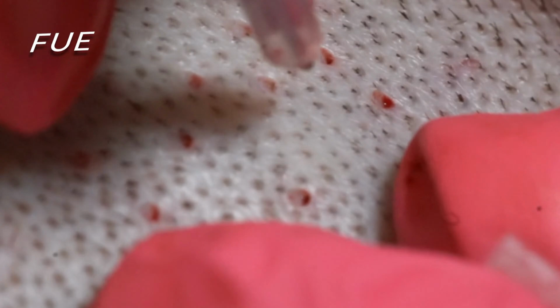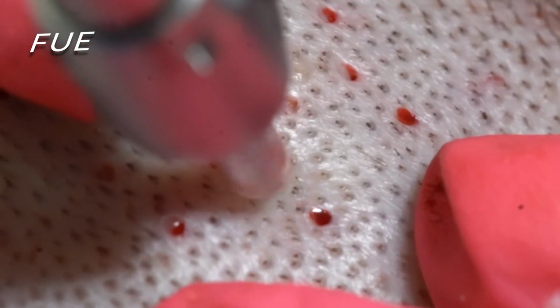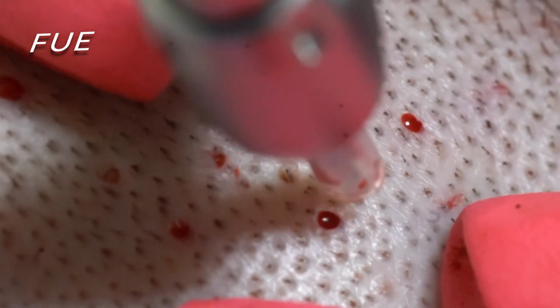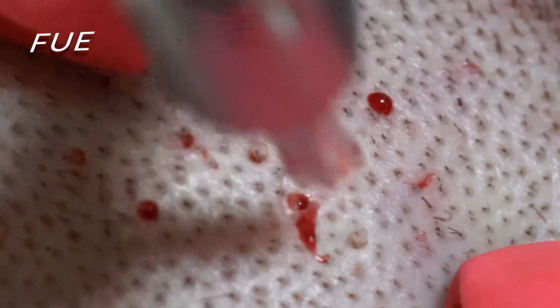Okay, so here we are doing the procedure. This is the standard FUE. You can see it's going to rotate around the hair and it's going to core that hair out. Now, we're going to do this 4 times, so it's just rotating and coring. And you can see there's a great amount of tissue around these hairs, and that's a perfect cut.